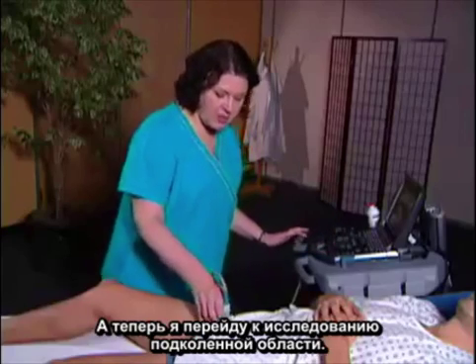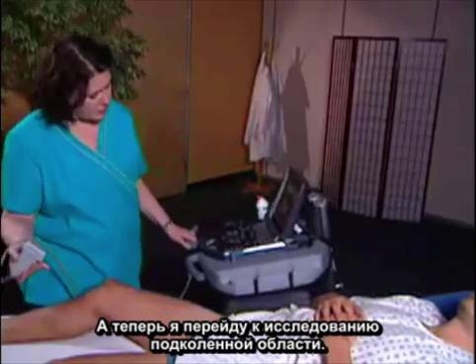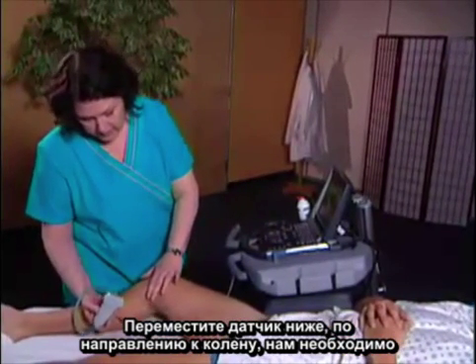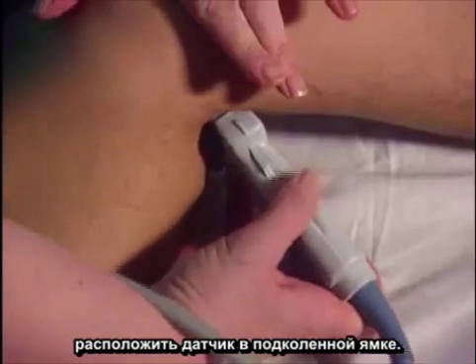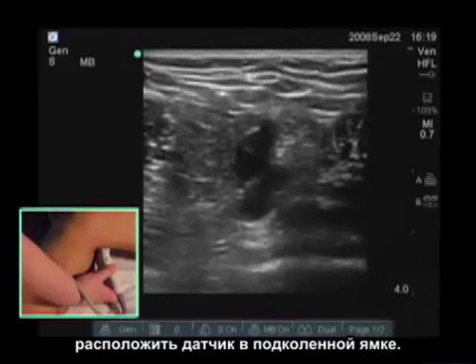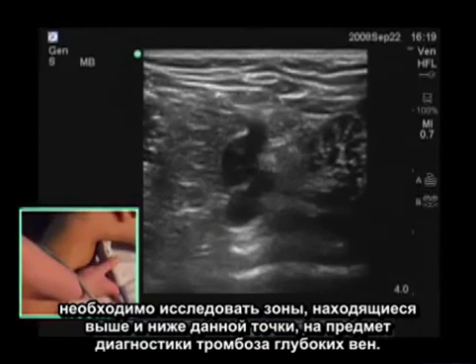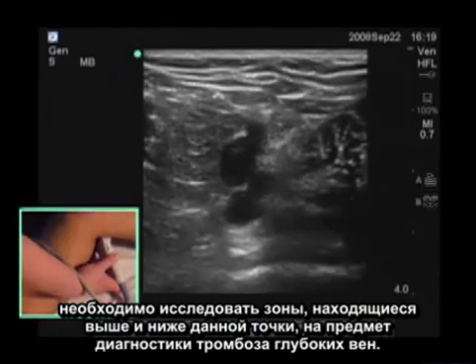From here, I'm going to move down to the popliteal region. Just move the system down towards the knee, and we're going to go behind the knee, putting the transducer into the popliteal fossa. Once you've identified the popliteal artery and vein at the mid-popliteal fossa level, you want to evaluate above and below this area to make sure you've assessed all those areas for deep vein thrombosis.